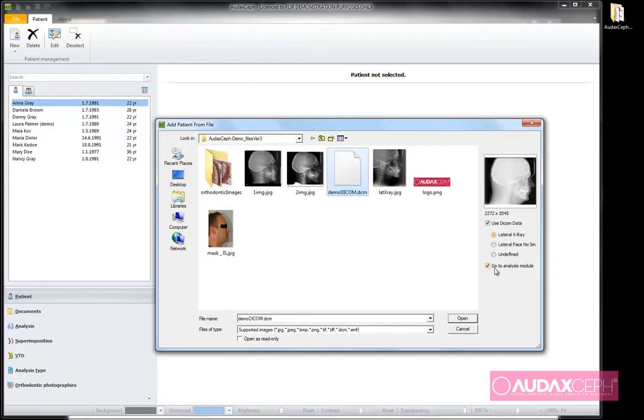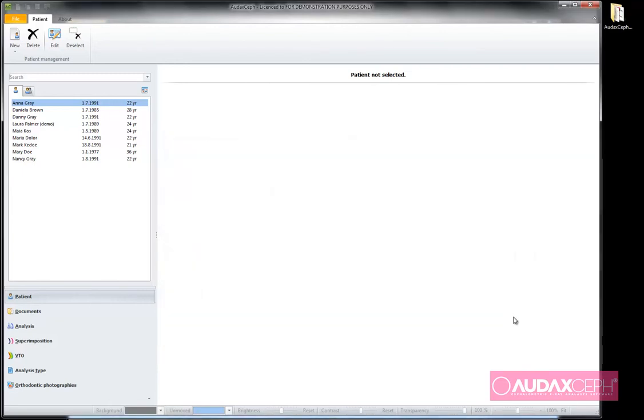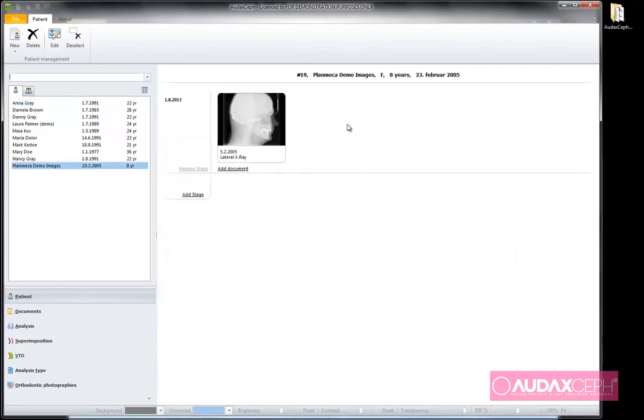System can take me directly into analysis module but I will uncheck this option and finally open a new electronic patient file. We can note that the file was created. An initial stage for treatment documents is already available for our use.